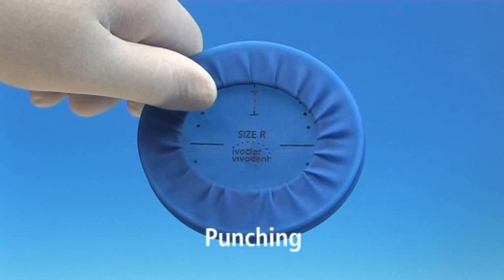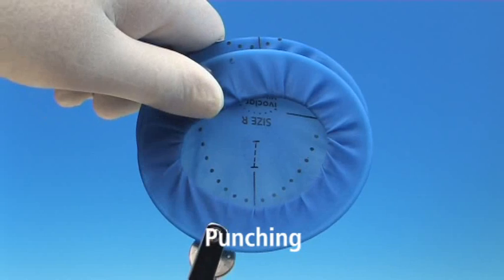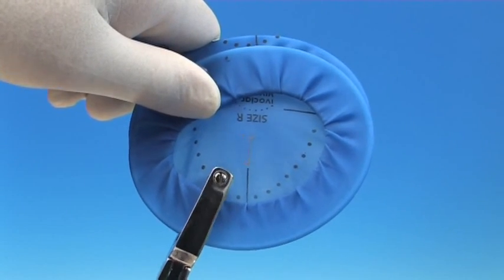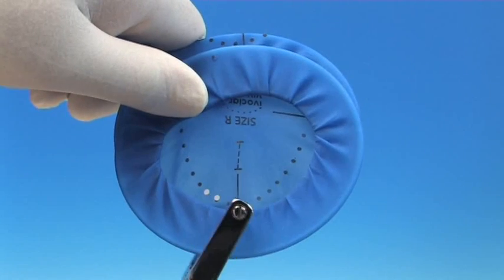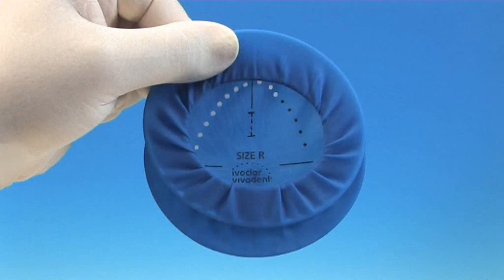For ease of locating the upper and lower side, the Ivoclar Vivadent company logo is printed on the Optredam. To facilitate the punching process, the dental arches are already pre-printed. To ensure clean cut margins, apply maximum pressure when using the punch forceps. This will help to prevent tearing at a later stage.